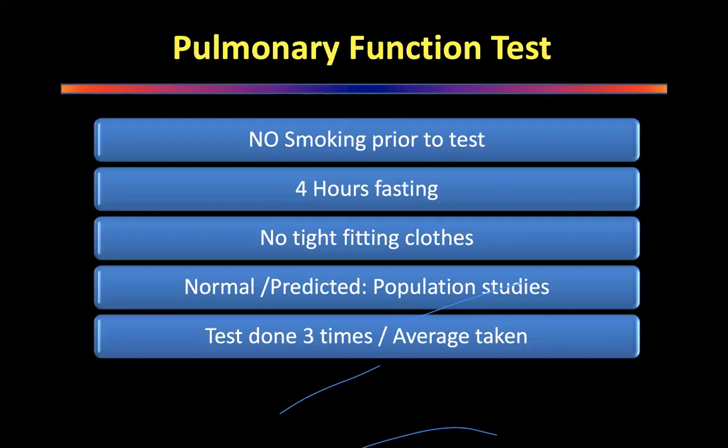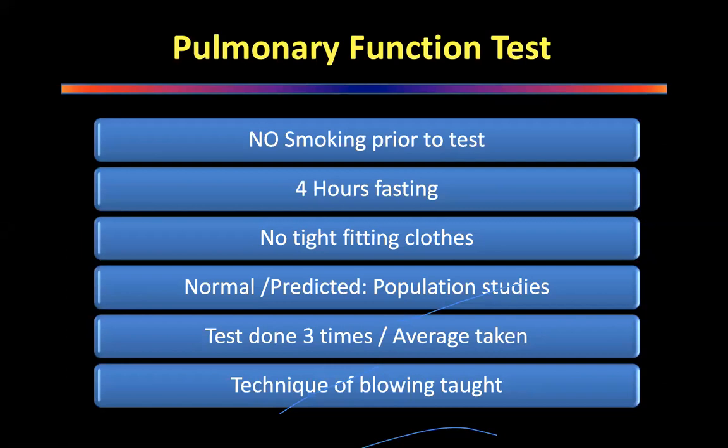Now the test should be done 3 times because it does take time for the patient to understand the technique of the test. Very often the test is not good because the patient didn't know how to blow. Particularly in the Indian scenarios, a lot of patients are illiterate or they are from the villages, and you try and explain to them, they're already worried about hospitals and machines and all that, and the technique is a problem. So it is very, very important to teach the patient the technique.